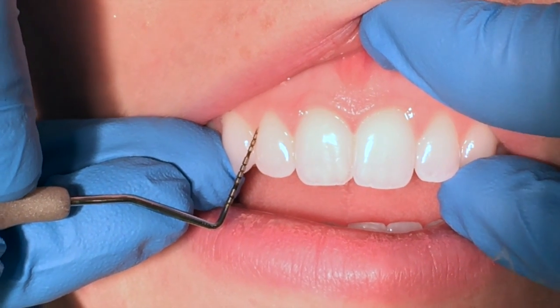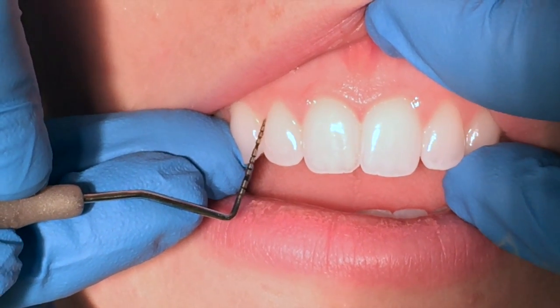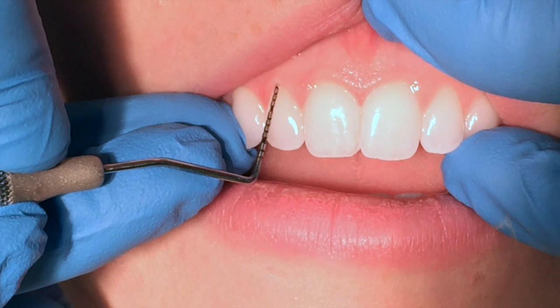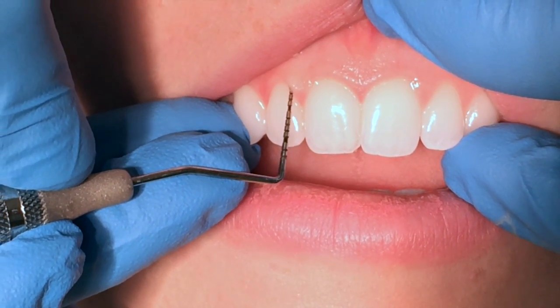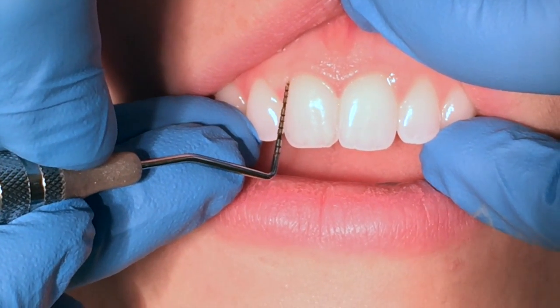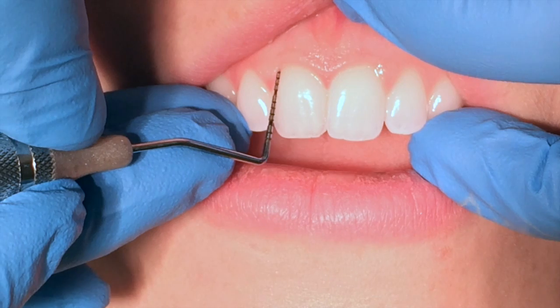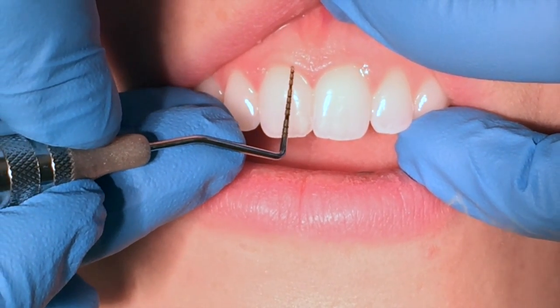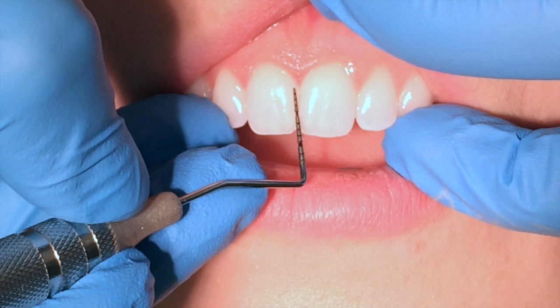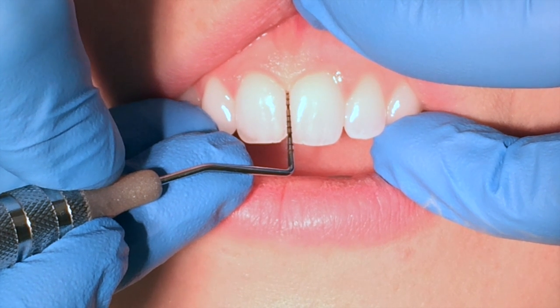Starting at her ready zone: keeping the last two millimeters always tight against the tooth, I walk the probe with light pressure, watching for the tissue to blanch at each position. At the interproximal, I tilt to 10 degrees into the col, then come out. I continue this pattern around the tooth — blanching confirming correct depth at each point, keeping my working end parallel constantly.